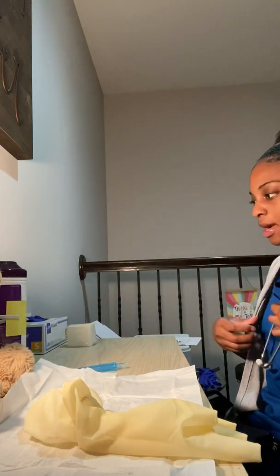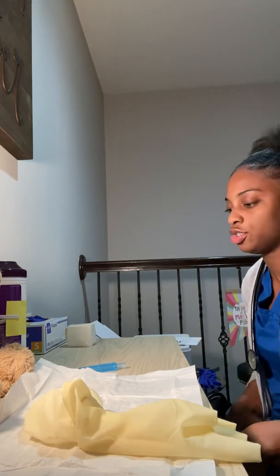So that would be it for my trach suctioning. I'll go ahead and hyperoxygenate her again if need be, and then go ahead and put the trach collar back on her trach and make sure she's comfortable and continue to monitor and assess her. Thank you.